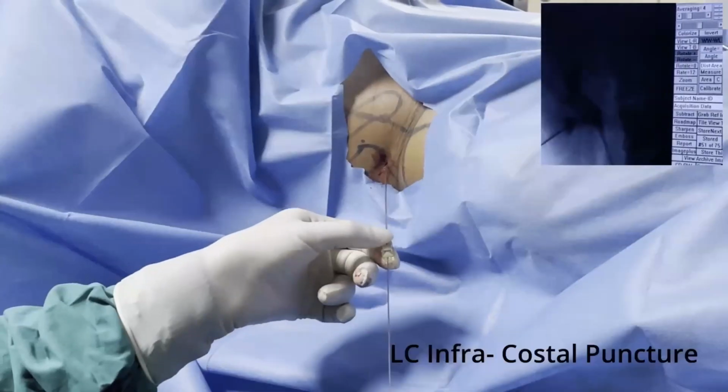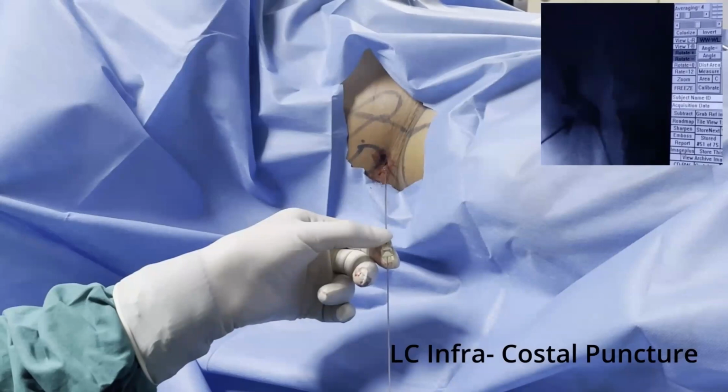As the needle is advanced in the lower calyx, we see whether the needle is anterior or posterior to the targeted calyx. So we rotate the C-arm towards the head end. If we turn the C-arm 30 degrees towards the head end, and the needle doesn't change its position, that is, it is in the same position as in the 0 degree, that means we have hit our calyx. If the needle moves a little bit upwards to the targeted calyx, then we again withdraw the needle, and we go a bit more anterior.